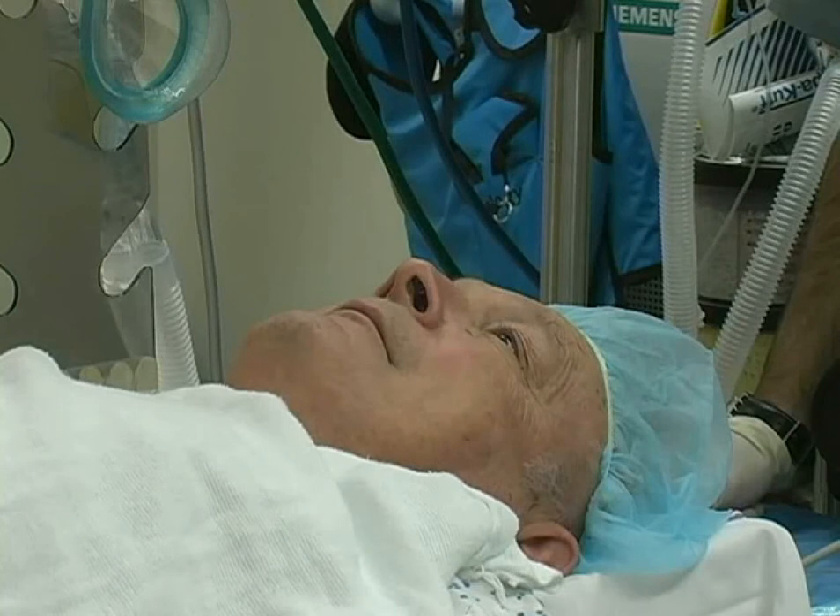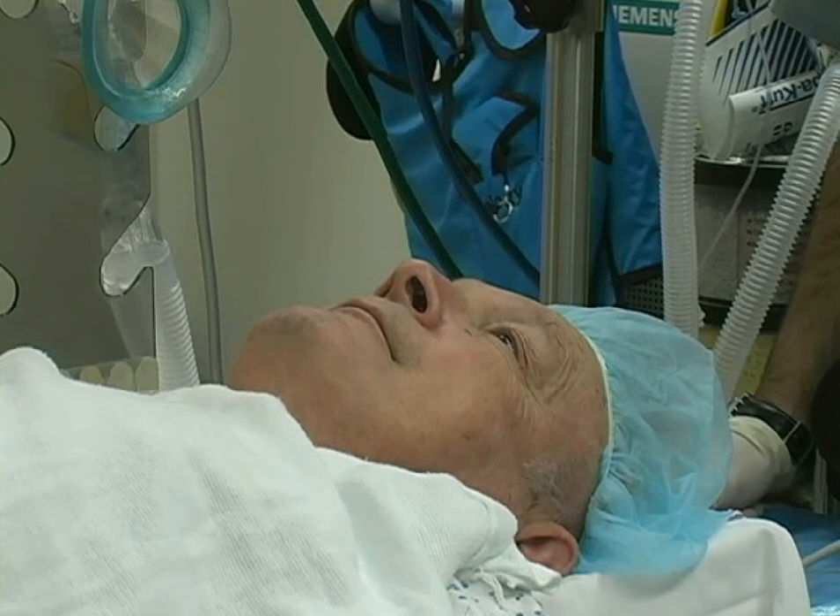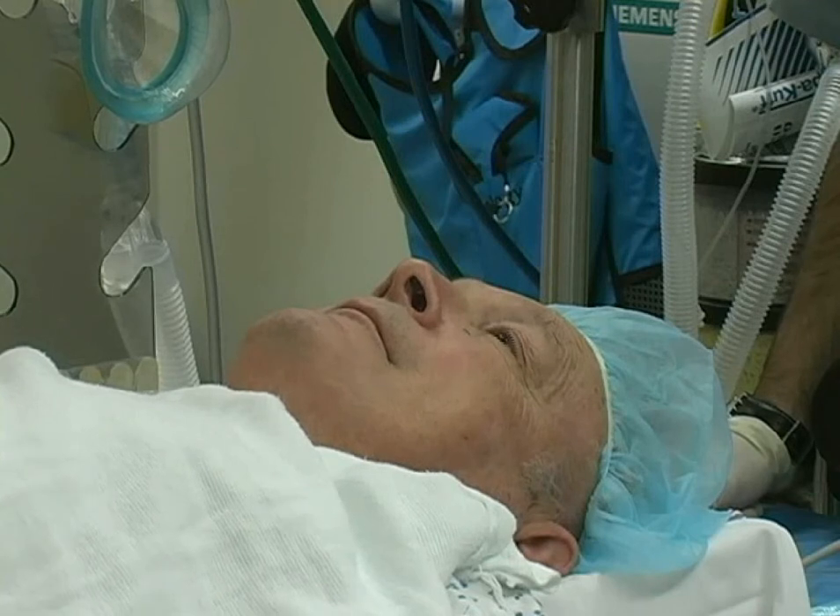The laryngeal mask airway, also referred to as an LMA, is a device used in airway management. It has a role in routine general anesthesia cases, but can also be used in emergency airway situations or in patients who are difficult to intubate with an endotracheal tube.